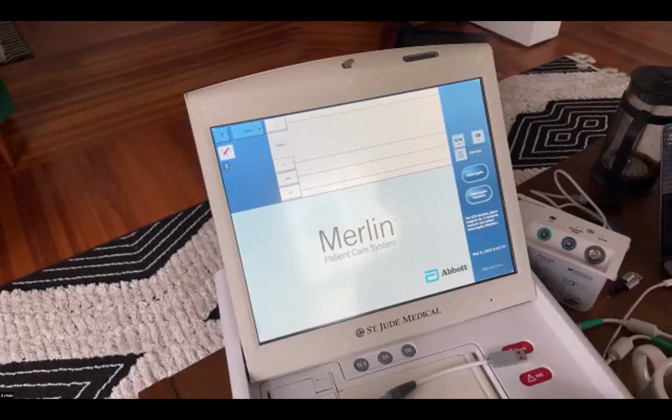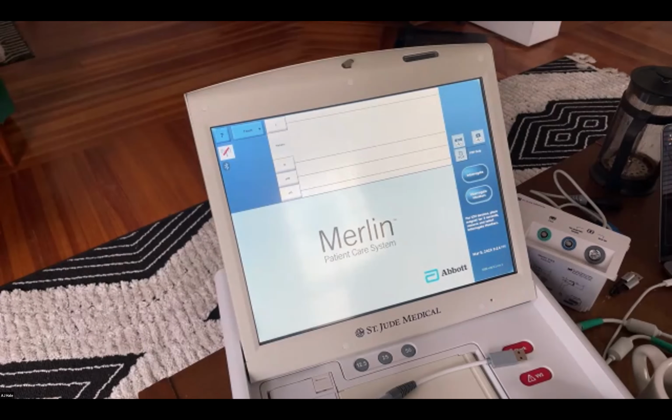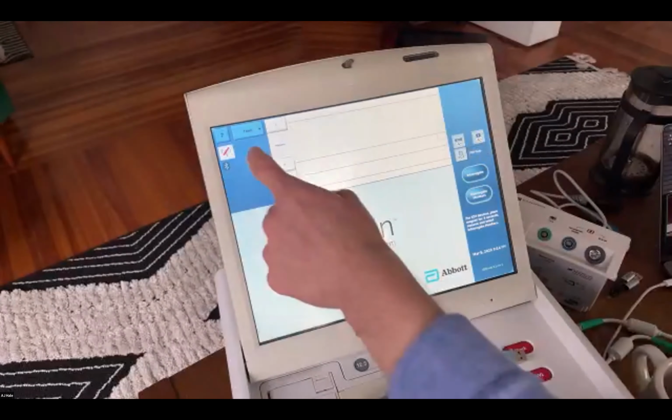Interrogate monitors work for the implantable cardiac monitors like the JOT DX or the Confirm RX devices, where it will actually interrogate using a magnet, which we could go into at a different time. These screens right here will go through when we actually get into a programmer.